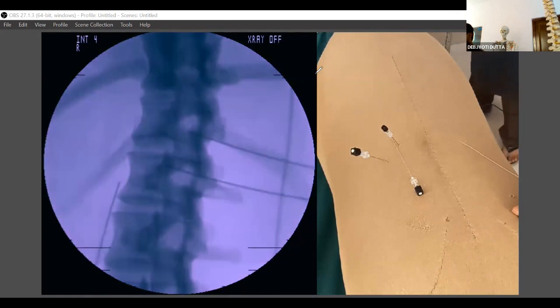Okay, so this is the middle of the triangle, right? So I'll be going by the tunnel vision. Here I'm not touching anything. So you have to check by the lateral view also. Once you think that, okay, you are there, then lateral view.